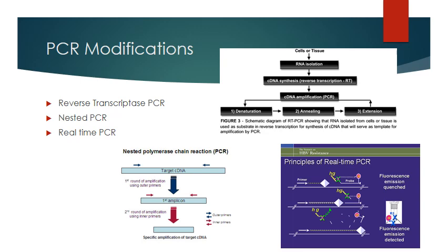Okay, so routine PCR is usually reported qualitatively. It's either positive or negative. Real-time PCR gives you a semi-quantitative or quantitative result, and this is the one that's used for a lot of our viral loads.